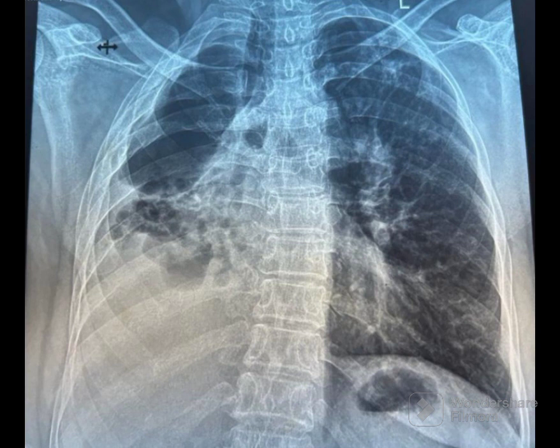Note the spine has a scoliosis with concavity towards the right. This sort of bending like a bow happens when there is unilateral fibrosis. These findings suggest right lung fibro-cavity. The large ovoid space without bronchovascular markings is a cavity.